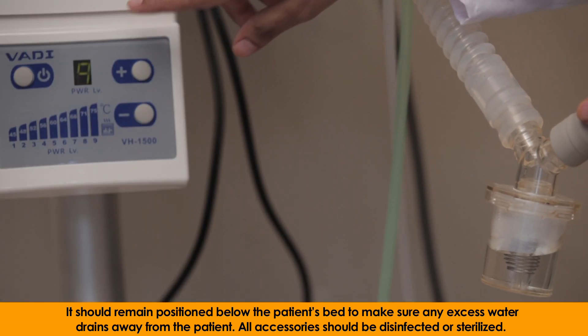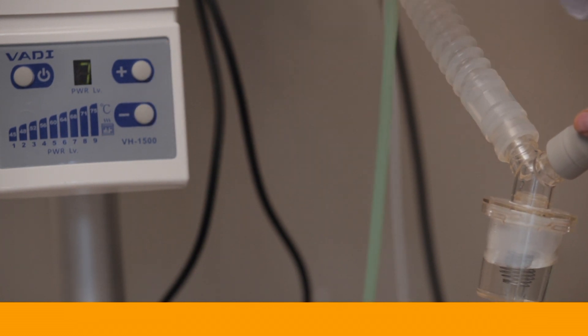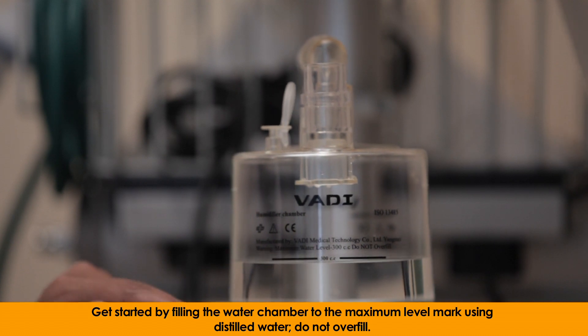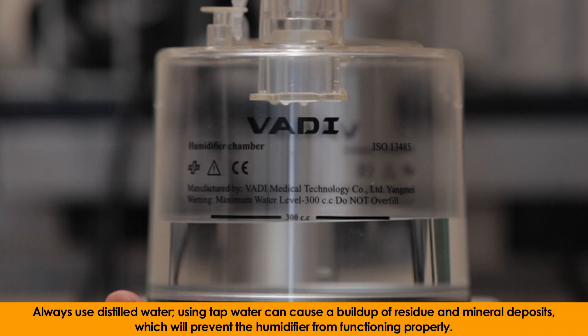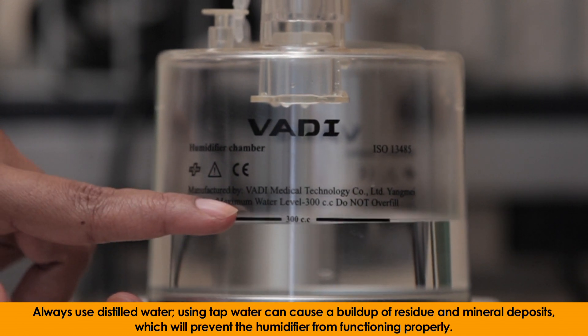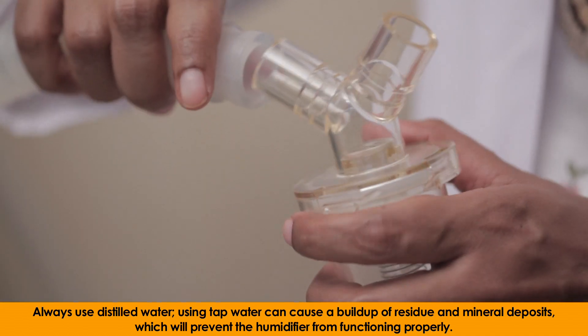All accessories should be disinfected or sterilized. Get started by filling the water chamber to the maximum level mark using distilled water. Do not overfill. Always use distilled water, as using tap water can cause a buildup of residue and mineral deposits, which will prevent the humidifier from functioning properly.